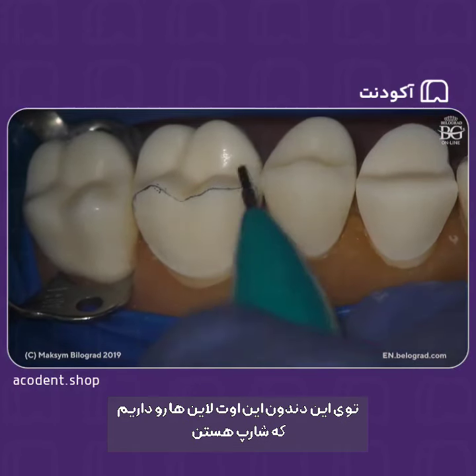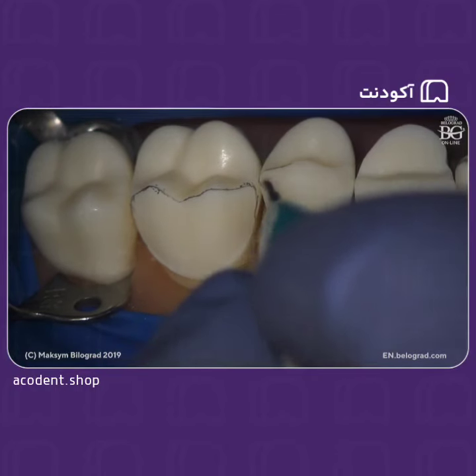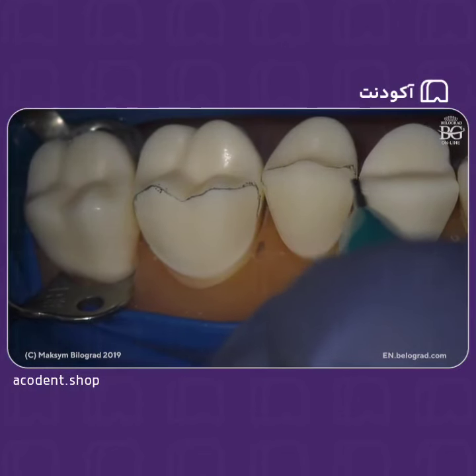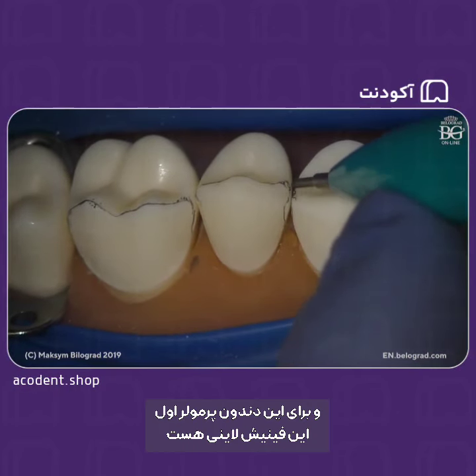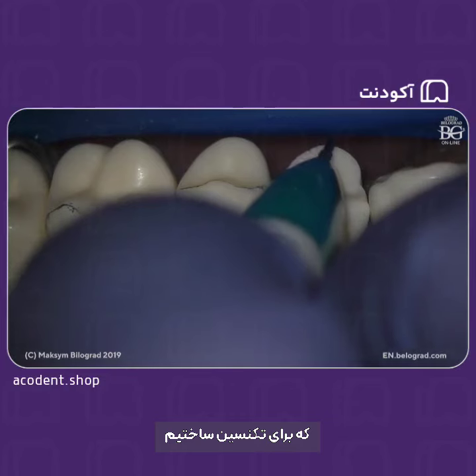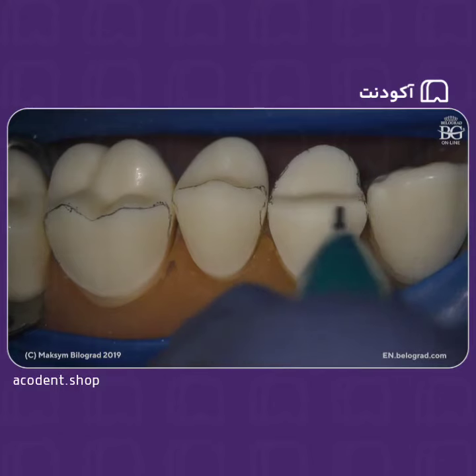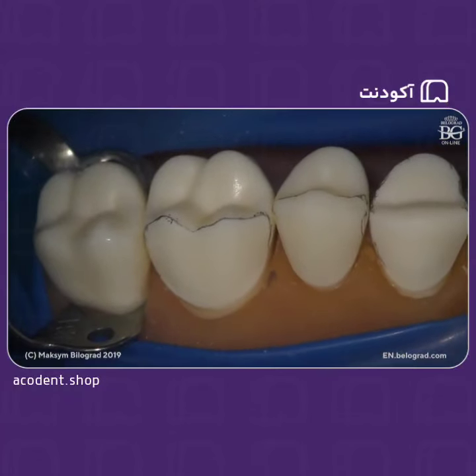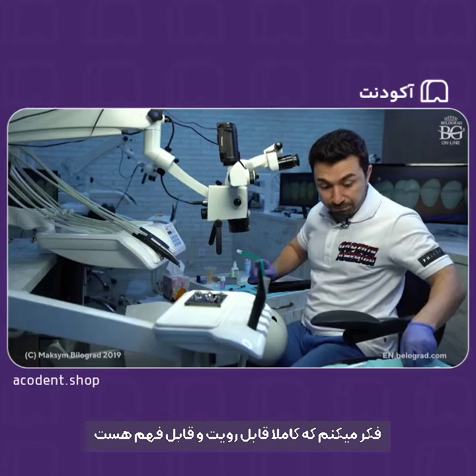Here you will have this thing which is sharp. And for this premolar, the first one, this is the finish line for your dental technician. I mean, this outline is the finish line for the dental tech. I think it's pretty visible and also pretty understandable.